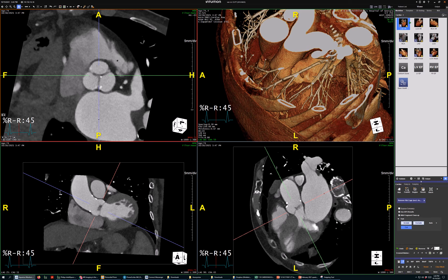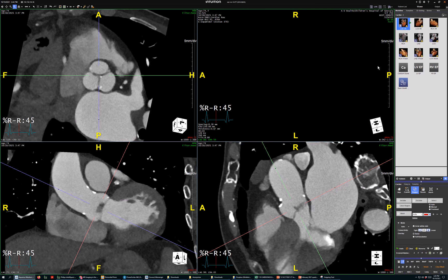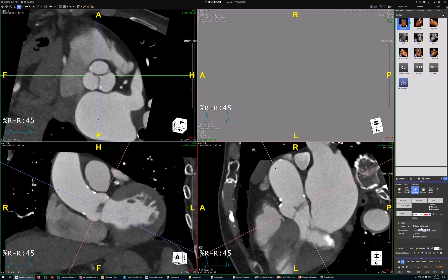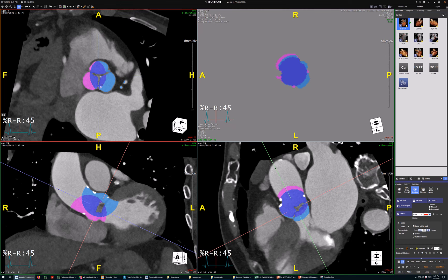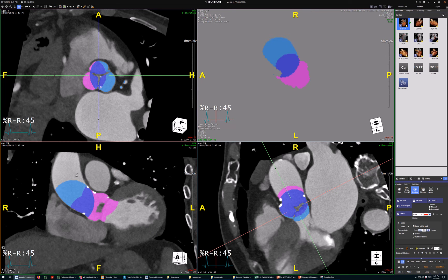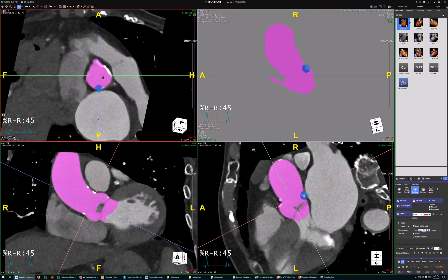Hold down the middle mouse button and push it up forward a little bit more to show it off better. Now come over here to region of interest growing, hit clear and reverse to clear object space — that's this 3D space up here. Put the background to gray. Now go to auto full resolution and just grow back in the aortic root without trying to get too much extraneous data in.